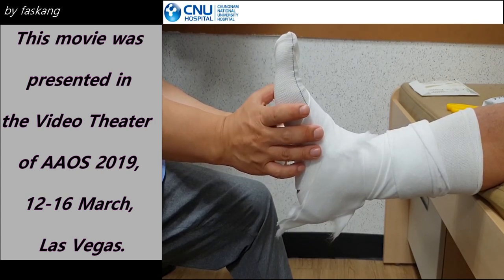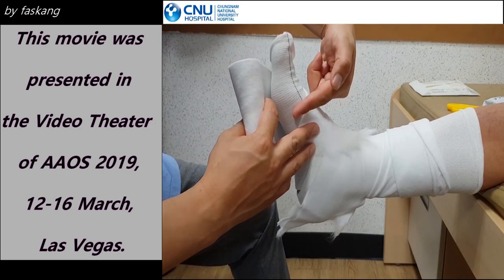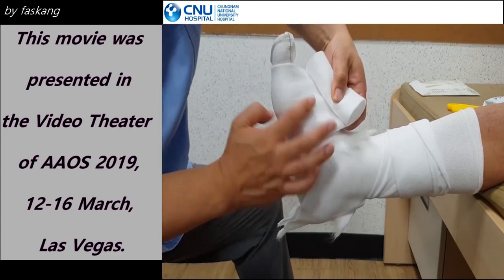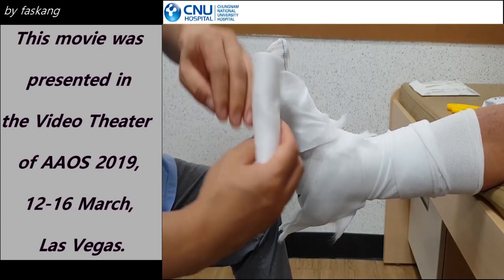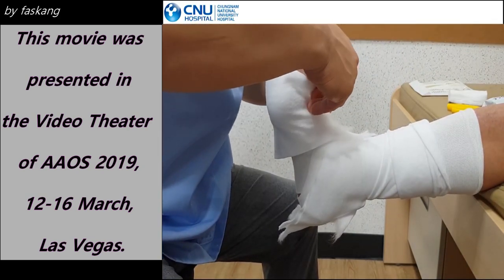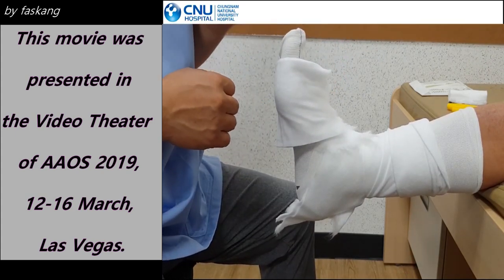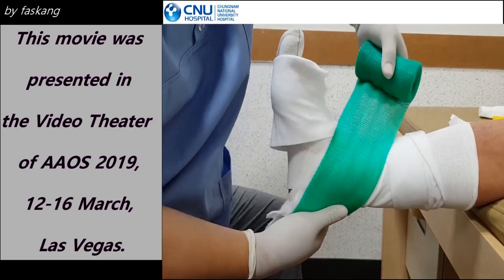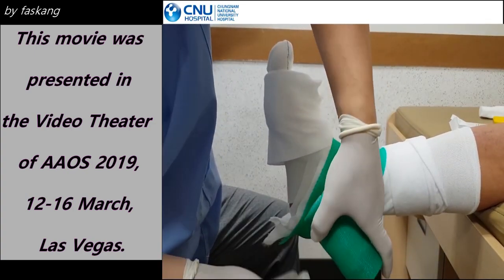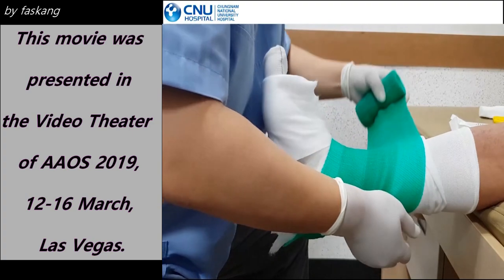When covering the foot with cotton, it includes the portion where bunion and bunionette occur and the distal portion of the metatarsal phalangeal joint. To open up the foot dorsum and make it into a quadrangular shape during appliance of the polyester cast, the cotton of the dorsum is torn. By starting the covering of the polyester cast from the whole heel area, it progresses proximally. The proximal end is managed by folding the proximal sleeve and cotton before cast appliance to prevent pain and skin problems that could occur by impingement of the polyester cast.